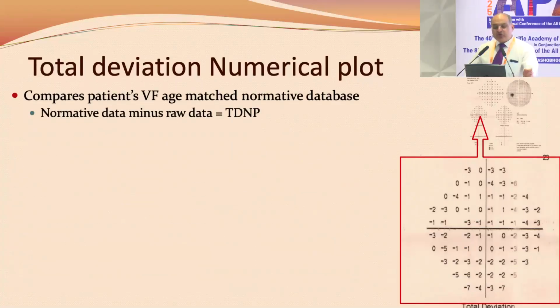Then we move on to the total deviation numeric plot. This compares the normative database with the patient's database.